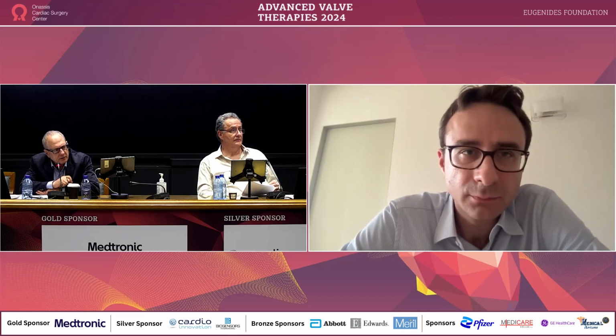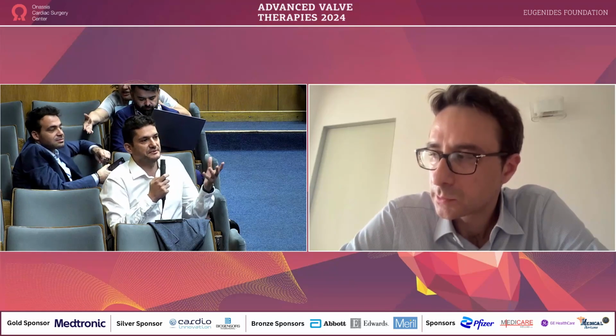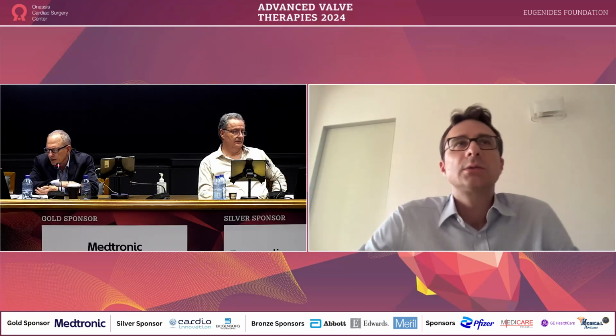Kostas Kalogeras, Professor. Thank you for the great presentation. Just a quick question regarding the way you assess any potential residual leak before you release the device. If I understood well, you assessed the leak by angiography or the TOE, and how does it affect your further decision? Do you reposition the device? And how do you assess the severity of the leak? Is there an amount of leak where you say, okay, I will release it, or do you want no leak at all? I don't know if you heard the question, Dr.